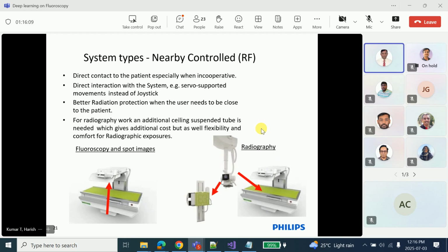All the combi systems stand apart and have many other features than the proxy system. I'm talking to people online. You can see the difference between a proxy system and a combi system. If I'm there, I will show you how it is different, how the radiation dose saving happens between proxy and combi system. But definitely, the combi system is far more superior than the proxy system.